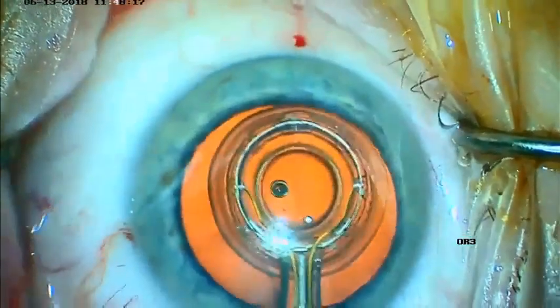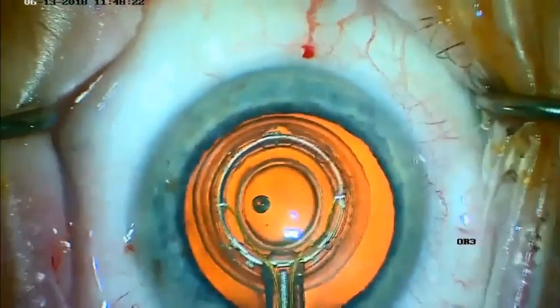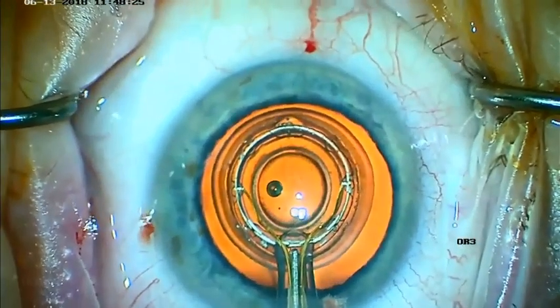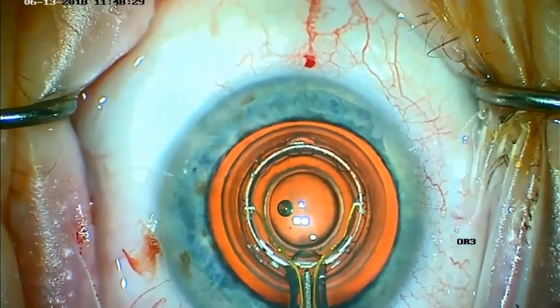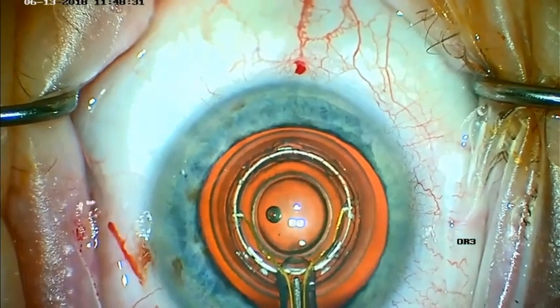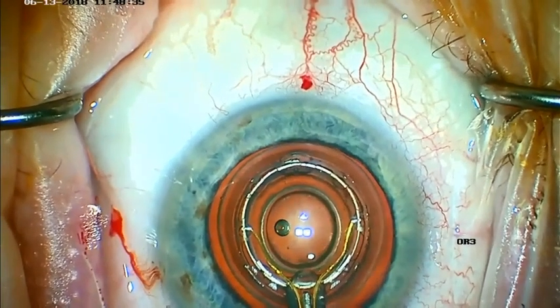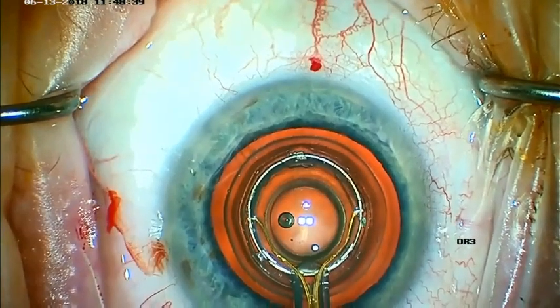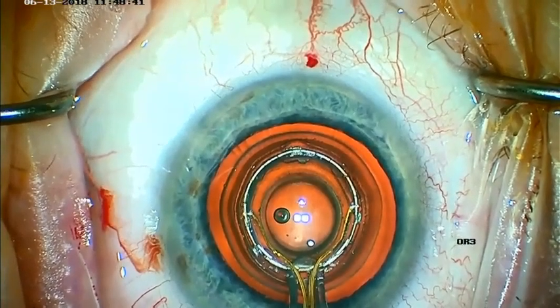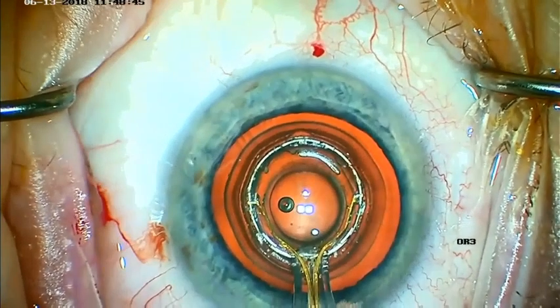This gives us good control of the device. We tilt heel up and tip down to ensure good applanation of the anterior capsule. We center the device — the silicone skirt — on the first Purkinje image, as you can see. Once well centered, we ask the assistant to turn suction on, and the push rod is retracted right away within a few seconds. Bubbles begin to emerge and are suctioned into the shaft.